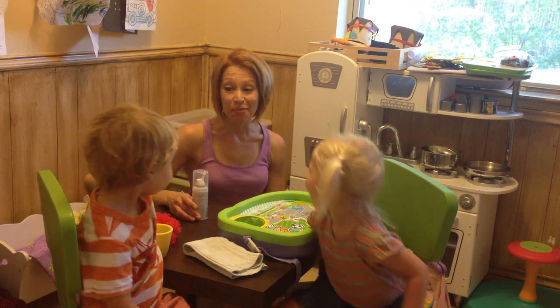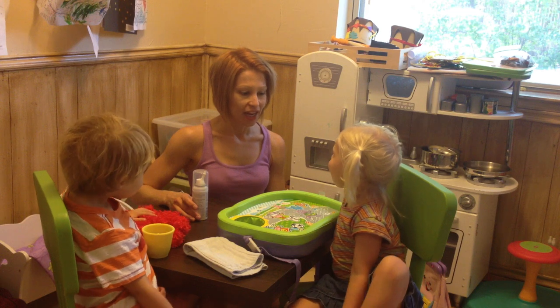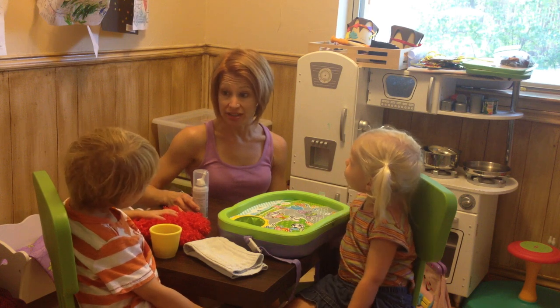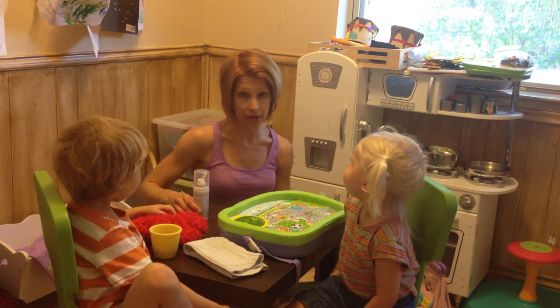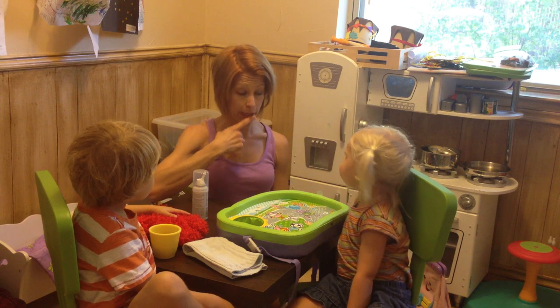Hi, this is Jenny from Conscientious Confusion, and these are my kids who are going to demonstrate to you how kids can do a saline rinse in their nose, which is a great way to prevent allergies and to help them when they start to have a plugged up nose or a runny nose.